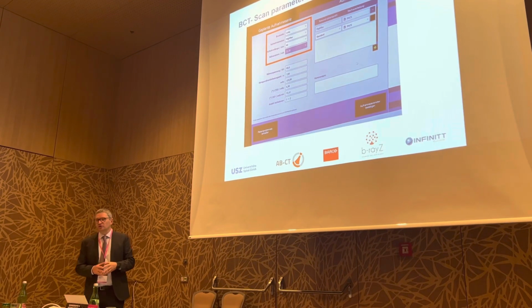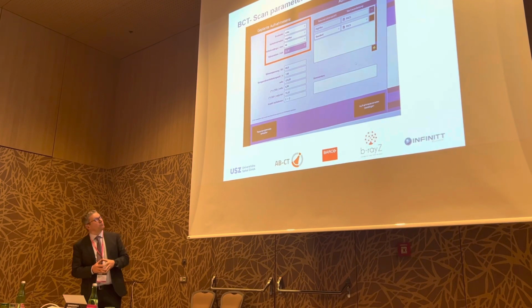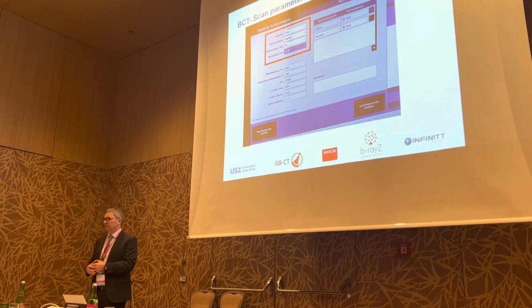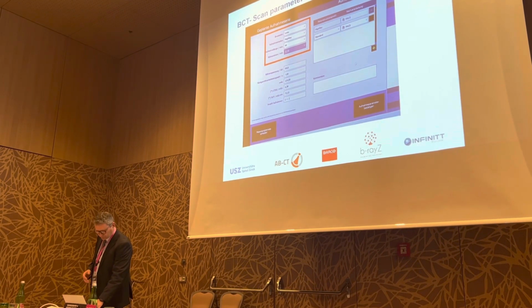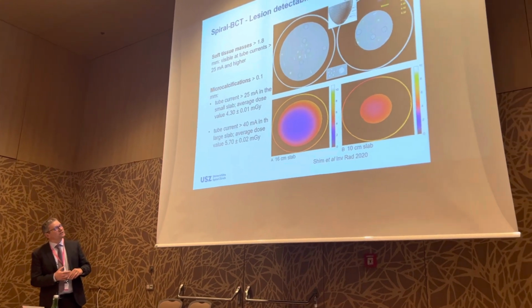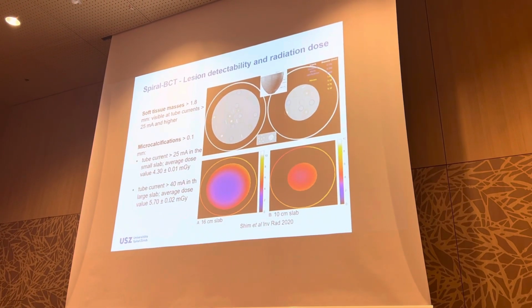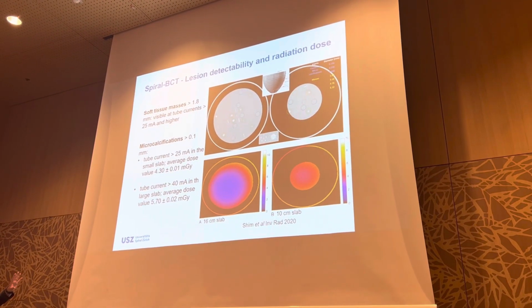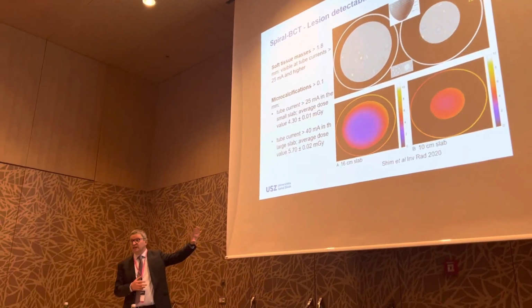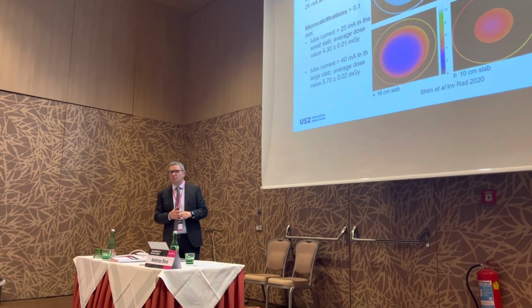And we at the University Hospital in Zurich always use 32 milliampere, which is a good compromise between applied dose and image quality. So, of course, we examine the quality of the images which we receive, first in phantoms, and using a dose between 4 and 6 milligray per breast, you are able to reliably detect microcalcifications and also soft tissue opacities.